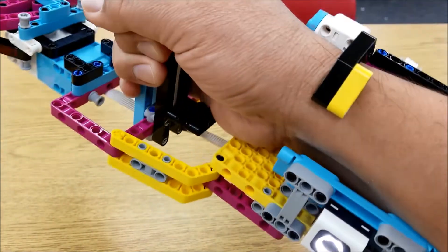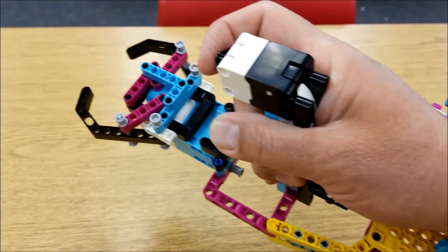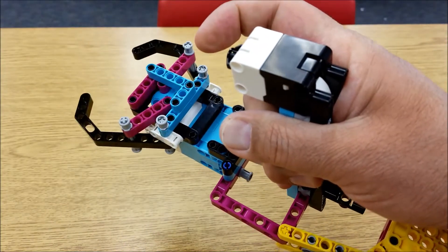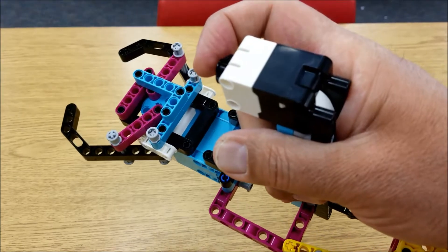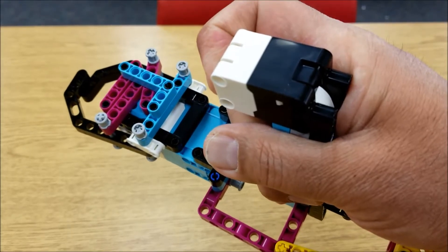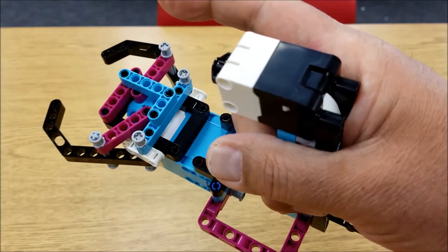Those levers come down and kind of lock your arm in. And if you have a bigger or smaller arm, it locks in a little better. Then when you press the touch sensor, I programmed it so that when you press it, it'll hold on to whatever you're trying to grasp, and when you let go, it'll release it with the claw.